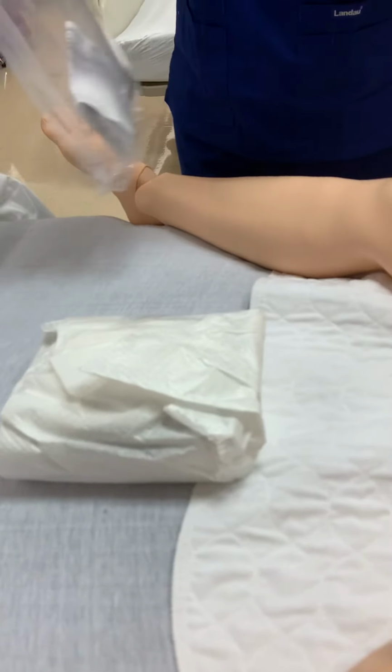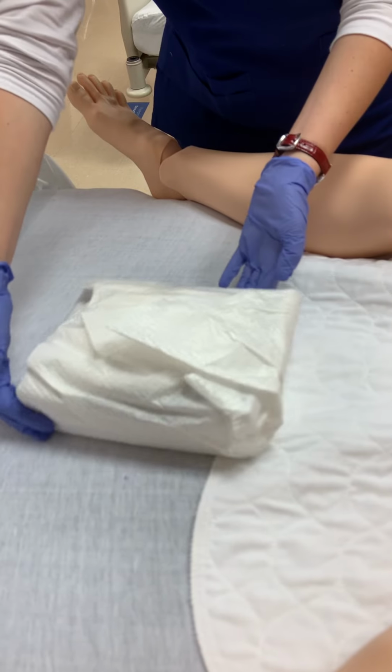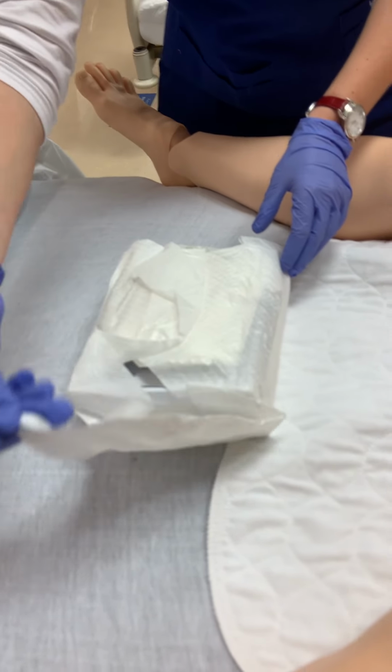This one, I'm just going to keep here for my trash. Make sure I have this side out.